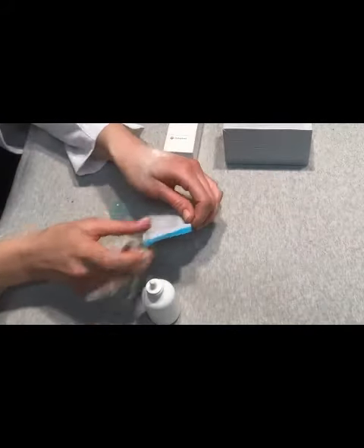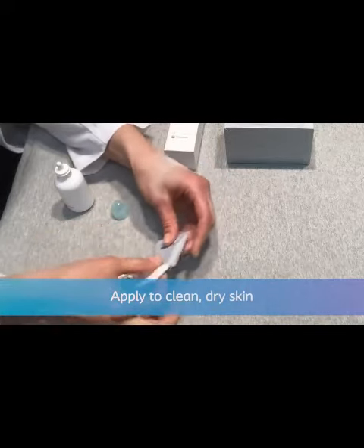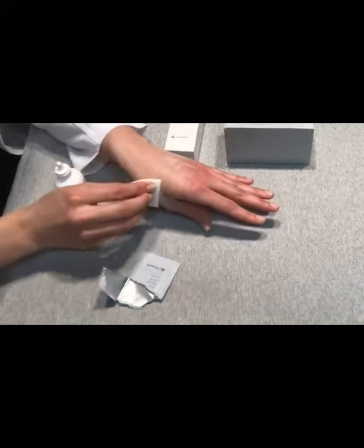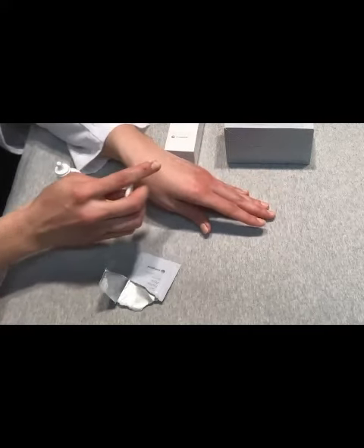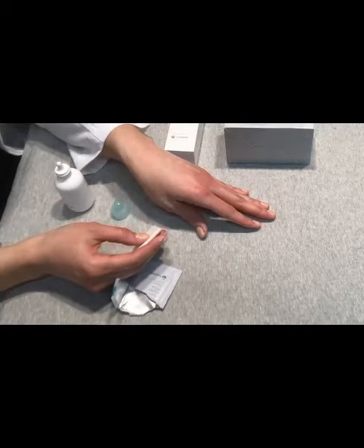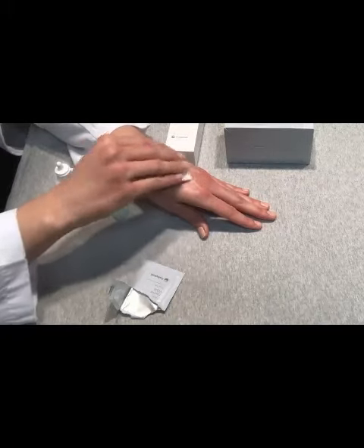That way, when you do seal with a barrier wipe, it will make a nice seal. You're not going to wipe off the powder — you're sealing it in place. This makes a nice seal around the irritated skin so that you're able to apply the pouch over the irritated skin. Be sure to seal all of the powder that's visible.